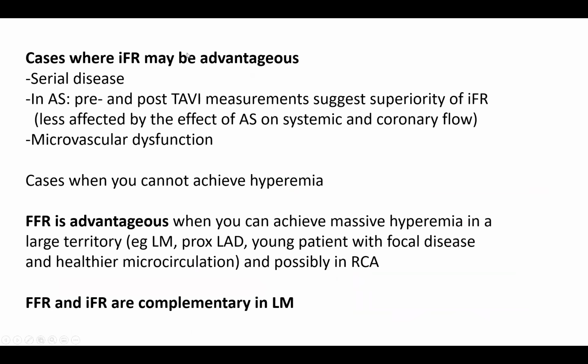So this is a summary of cases where IFR may be advantageous: serial disease, aortic stenosis, microvascular dysfunction. Those are cases where you cannot achieve hyperemia, so IFR is maybe more advantageous than FFR. And actually IFR may be abnormal while FFR may be normal, above 0.80.